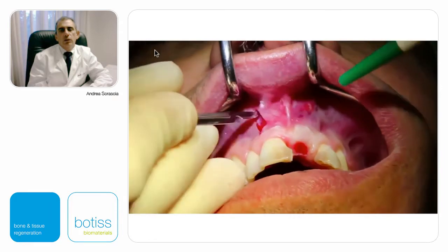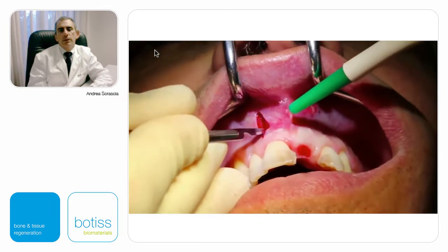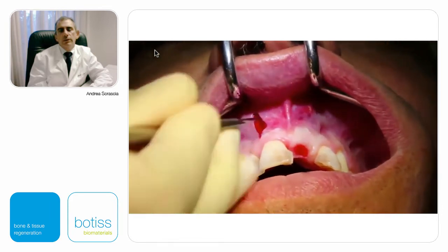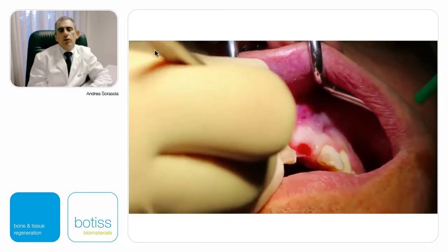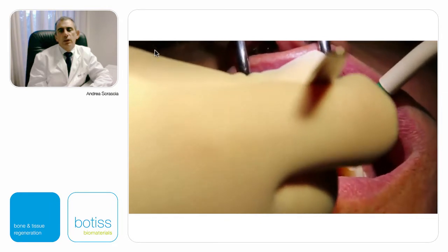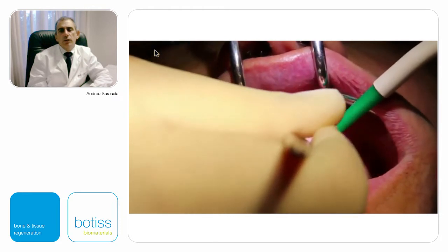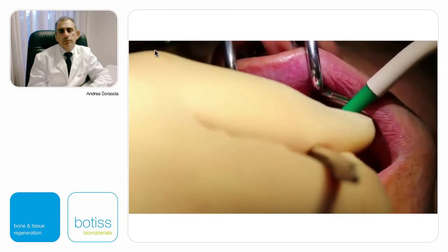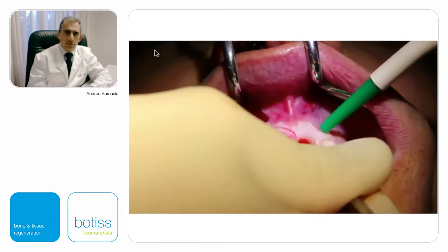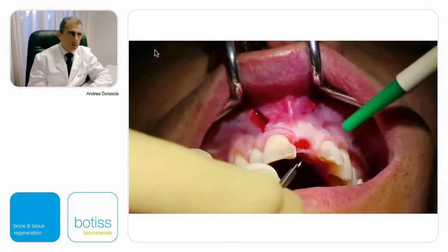And also to observe, because this is the phase and the step that I use to insert the implant. But I would check the regeneration of the bone tissue and the thickness of the soft tissues too, that I obtained with the regeneration using Mucoderm membrane.